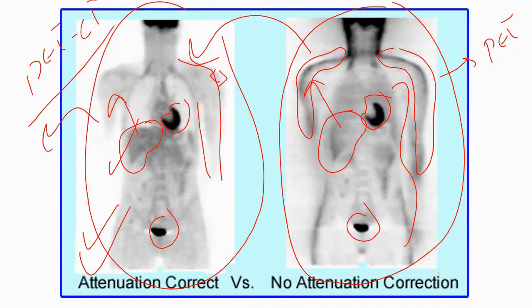It arrived, right. Okay, doctor, so if I have a nodule, because I had a story talking about a nodule, and there was a doctor saying it was evaluated with non-attenuation correction, this nodule was evaluated and considered positive for metastasis. Is that wrong? Of course, it's wrong.